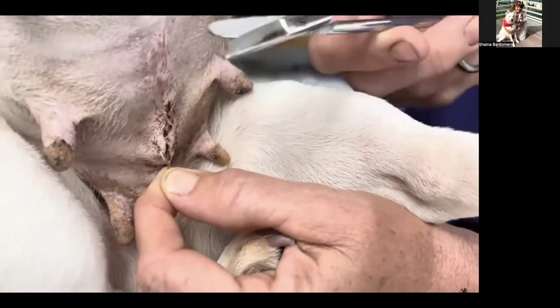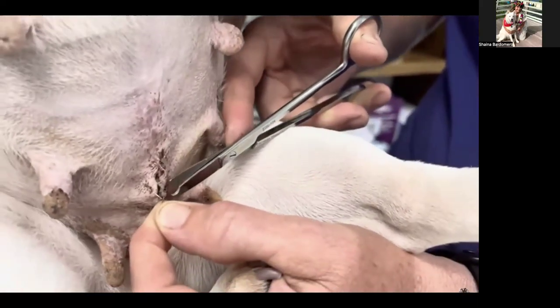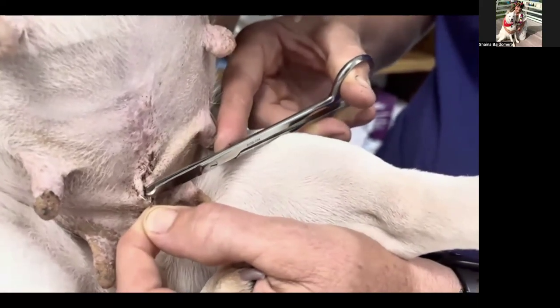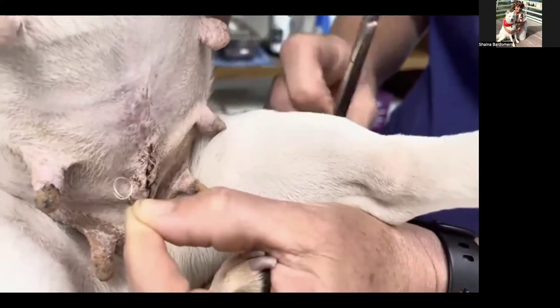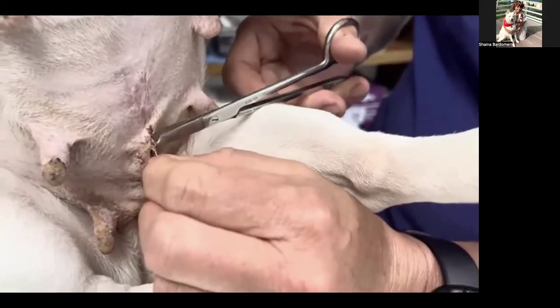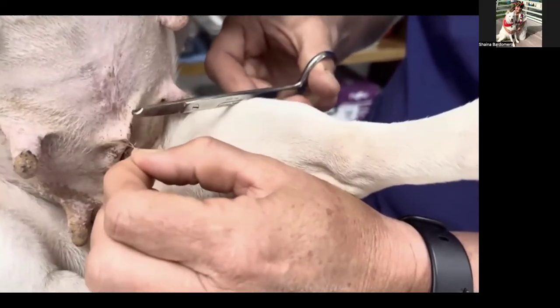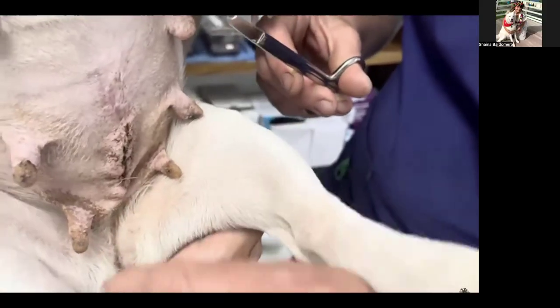Now, I'm using suture scissors. The best thing to use at home is a toenail scissors or even a toenail trimmer. So one side and pull, and that's what I mean by the curly Q. Second one, I just hold on to the string, cut one side and pull it through for a curly Q.